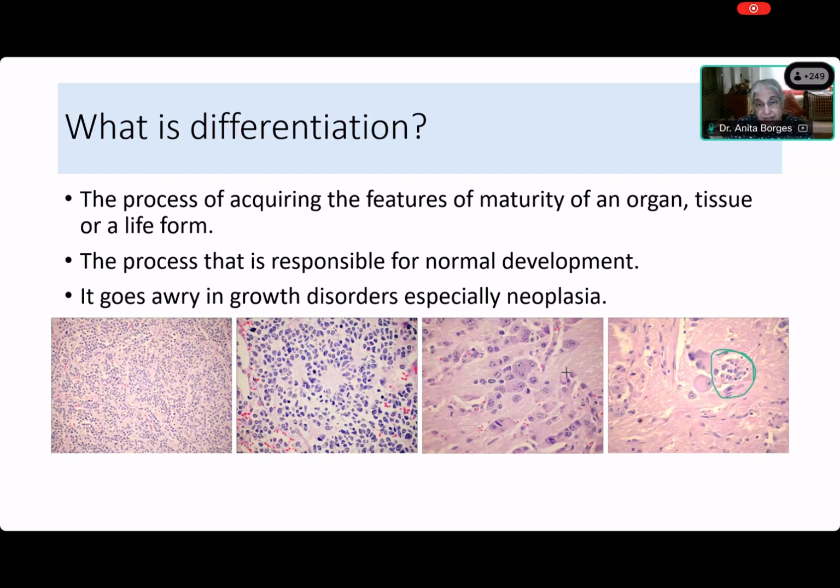It's made up of all these little hair-like processes that are present in the background. So now you tell me, anyone who is there, Amrita? We are seeing four pictures. At the beginning, the first picture, you're seeing nothing but round cells. Second picture, rosettes. Last picture, ganglion cells. And in between, you see something that is neither a ganglion cell nor a round cell.